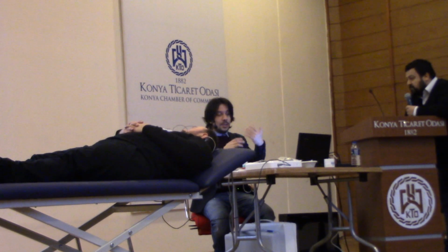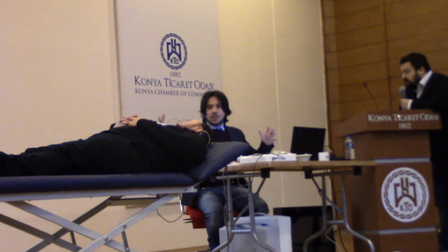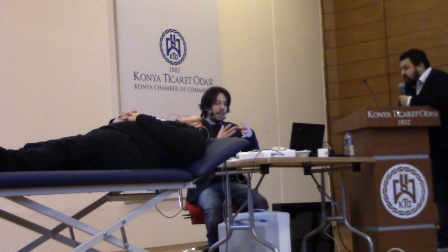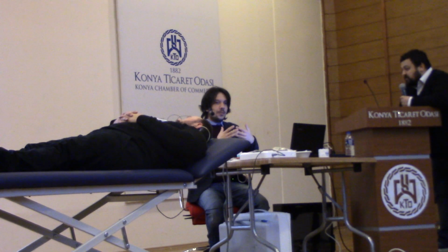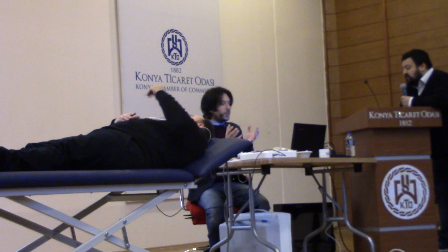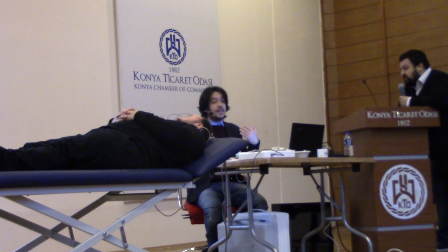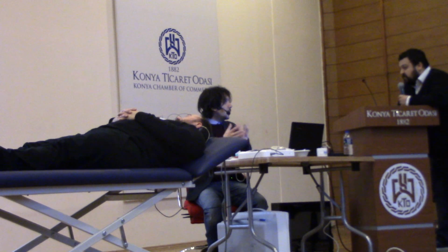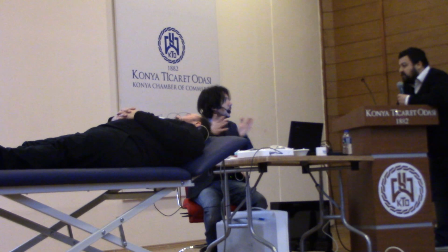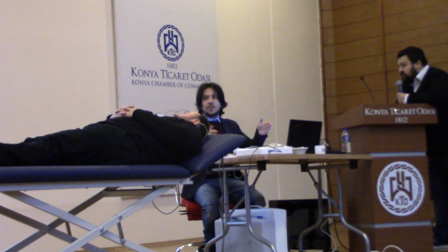The click or any stimulus you are using can have a range up to even 10,000 hertz. The stimulus frequency is acting on the cochlea, on the tonotopicity of the cochlea, but the response comes from the brainstem, and the frequency of the response of the brainstem for this kind of stimulation is in the range of 100 to 2500.